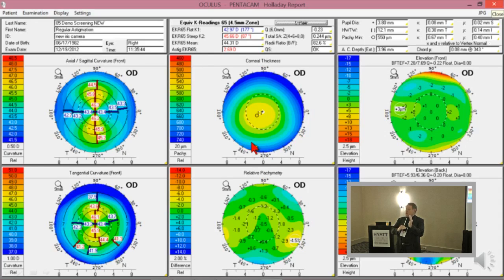So if the cornea was, say, 1/2 diopter steeper than normal, so that the back surface power would have been 1/2 diopter less, well, then it reports, instead of 45, it reports back to you 44.5, because it takes the abnormality in the back surface of the cornea, compensates for that, and then gives you back the K reading that you should enter into every formula available today so that you come out with the right answer.